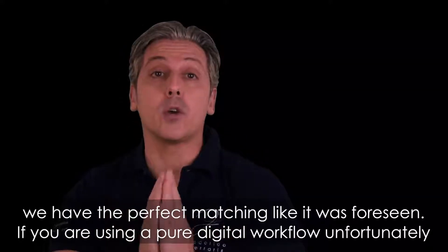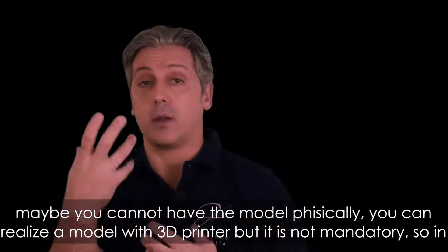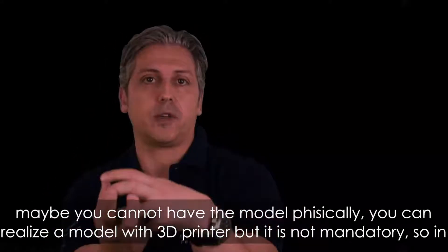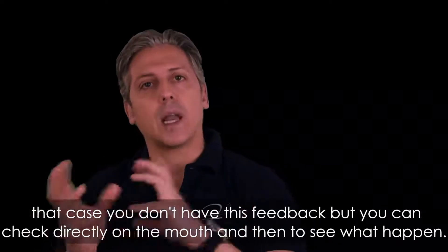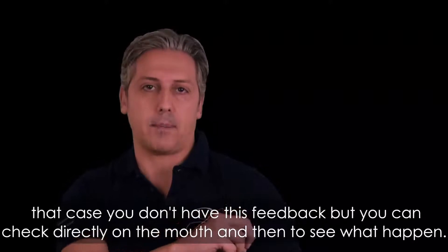If you are using a pure digital workflow, unfortunately you may not have a physical model. You can create a model with 3D printing, but it is not mandatory. In that case, you don't have this feedback from the model, but you can check directly in the mouth and see what happens.